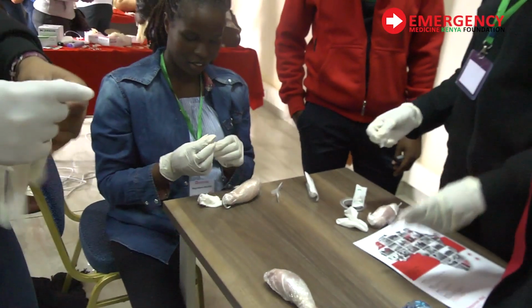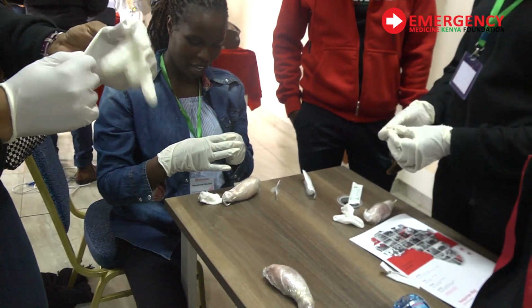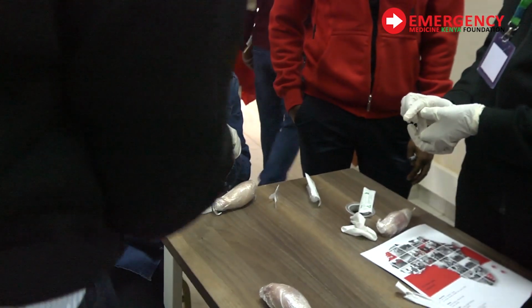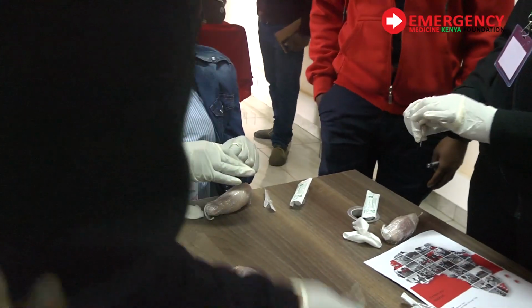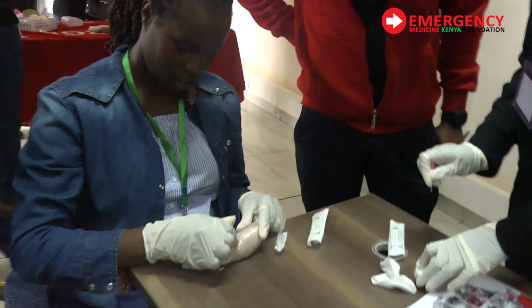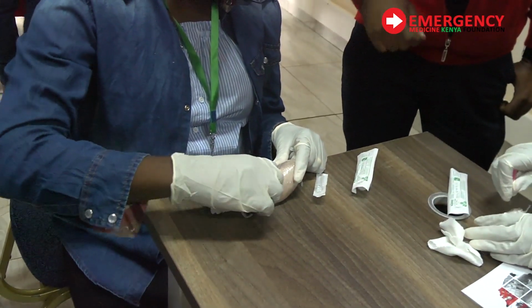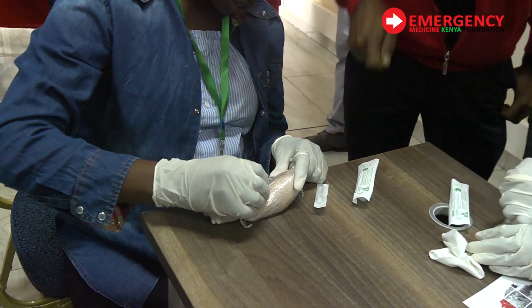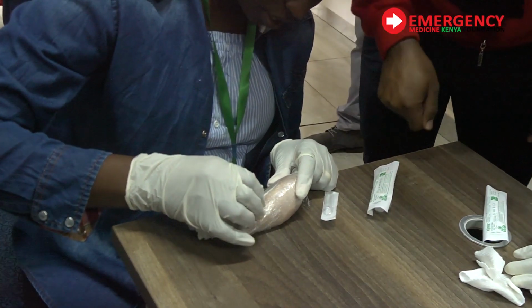No, it's not possible. There is no bone that is long enough to go that much. What about the other needles? The bigger needles, bone marrow. Yes, they are there. If you can procure them, they won't be able to go through. Remember, if you were able to go through, you would have chosen that side, the posterior side. But on that side, the bone is very compact. So the moment you are in, it will not even allow you to go through because blood is already coming out. So you will not put more pressure.